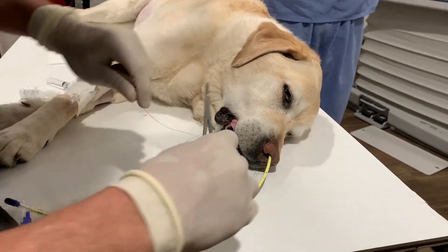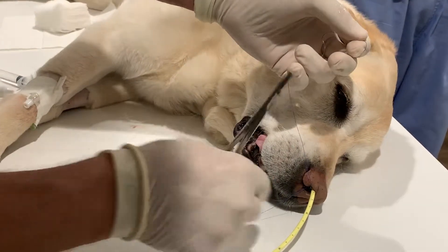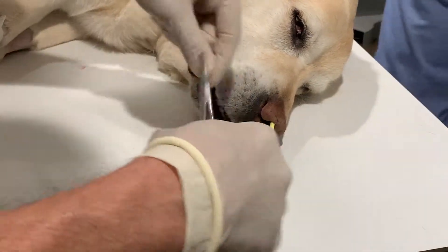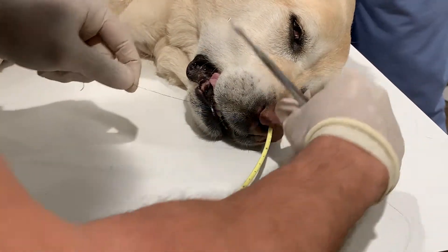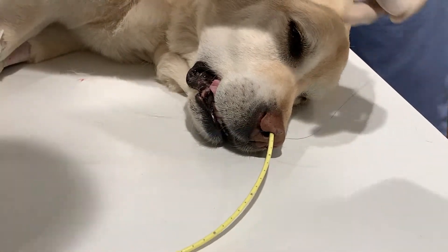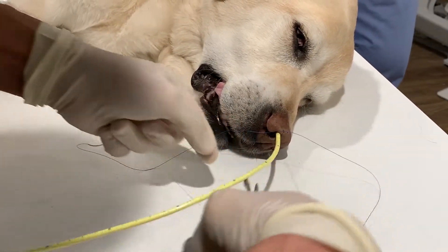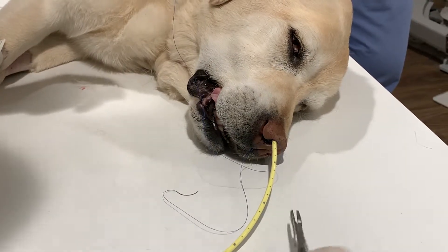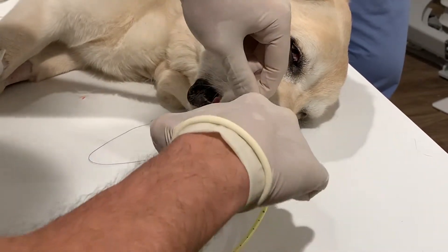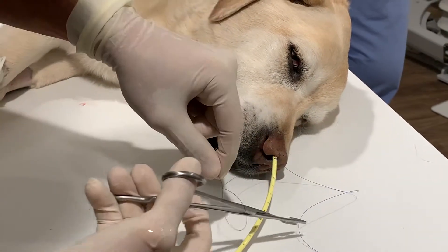We're then going to do what's called a Chinese finger trap. If you've ever seen those toys — as you pull the Chinese finger trap tighter, the mechanism itself will tighten. We do the same thing with the feeding tubes. We'll do about four throws, and then circle towards one end, circle to the other end, so you get that kind of pattern. Then tie again — for these subsequent knots we're going to do a surgeon's throw and then maybe just two throws instead of the four we did for the first anchoring suture.